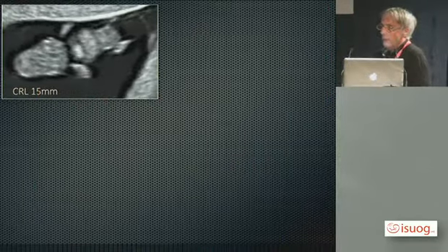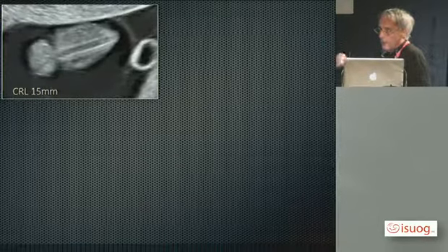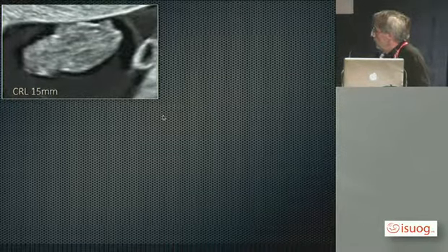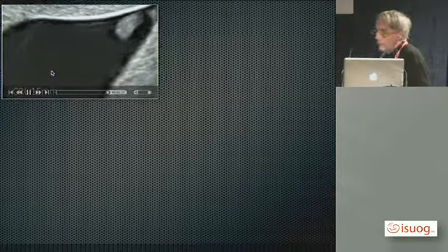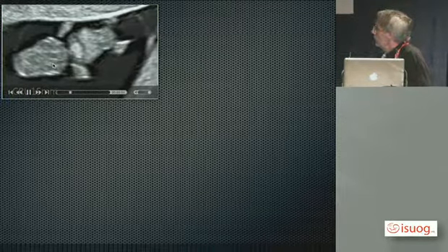This lady, this was last year, and this lady was pregnant again at the end of the year. At the same stage, she came, 15 millimeter, no brain cavities, and also you can see something on the back. You will see it here.